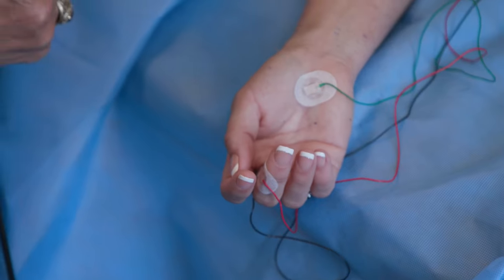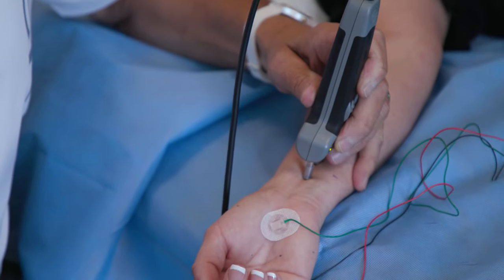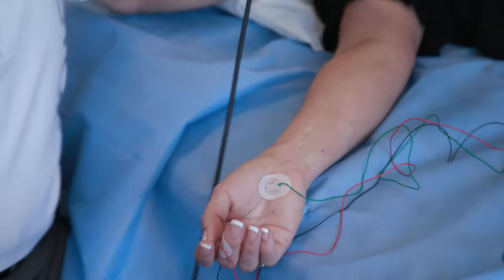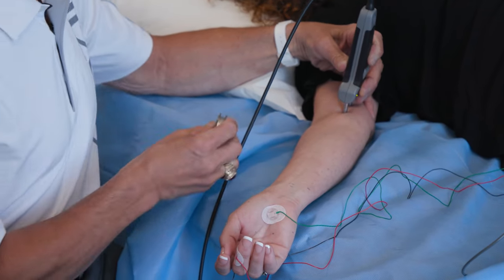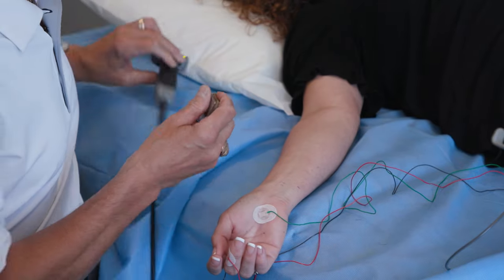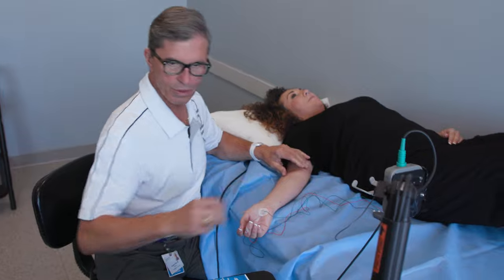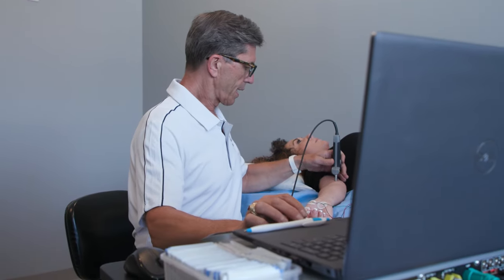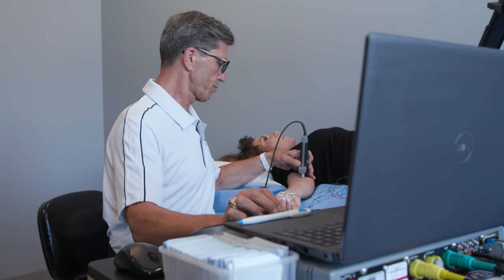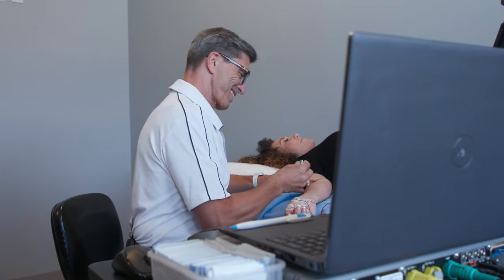We're going to do the same thing here — small shock over here, and one up here. This might move your hand a little bit, a little twitch — that's normal. You have to be honest with me if it's uncomfortable because we can usually modify that. 21 — perfect. And this one might move your hand a little bit once again. This is probably the worst one. It's annoying, but still doing okay?